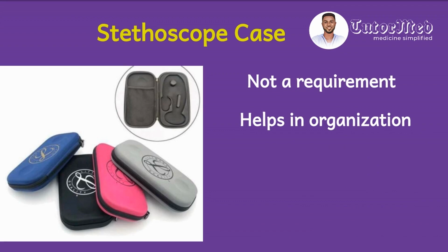So a person who has the stethoscope case looks organized and then looks prepared for the exam, in the eyes of the examiners anyways. And so this is not a requirement, but it helps you in your organization if you have one.